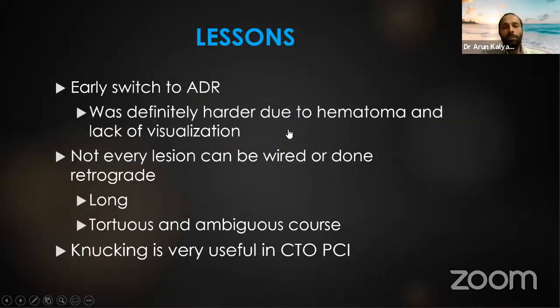So the key lessons from this particular case was you want to switch to ADR early, not spend 2 hours trying to wire it. So it was definitely harder because of the hematoma and lack of visualization. Not every lesion can be wired or done retrograde or antegrade wiring for that matter. And even in the hands of experts, not every case can be wired antegrade. And knuckling is often useful in CTO PCI.